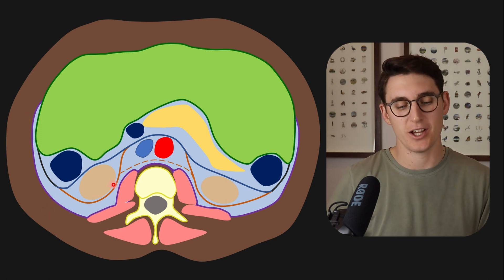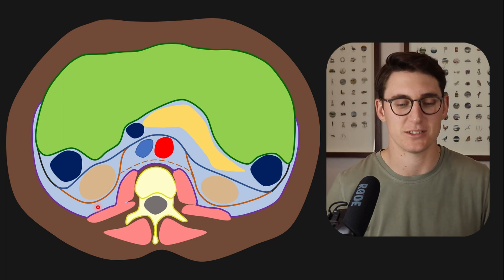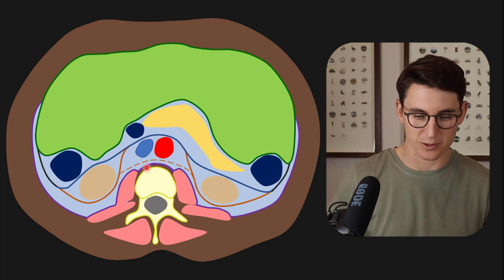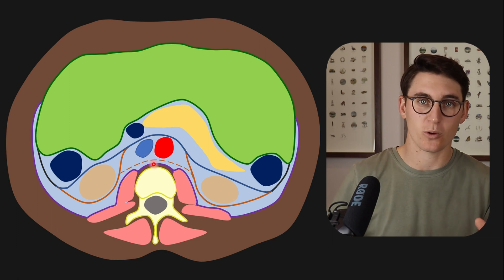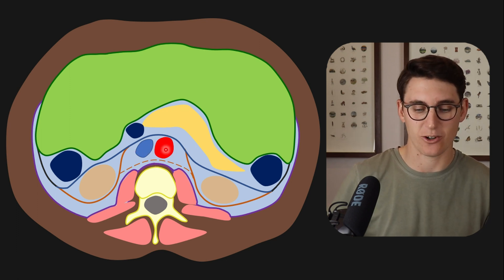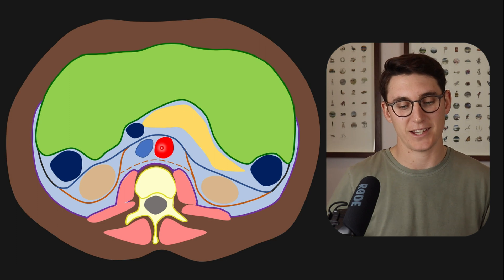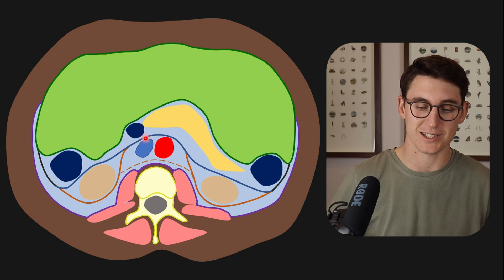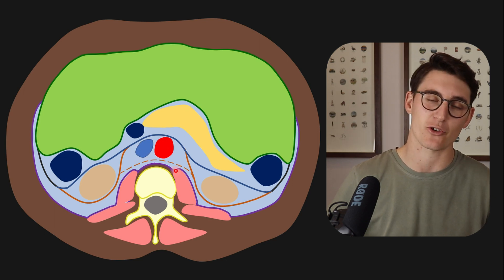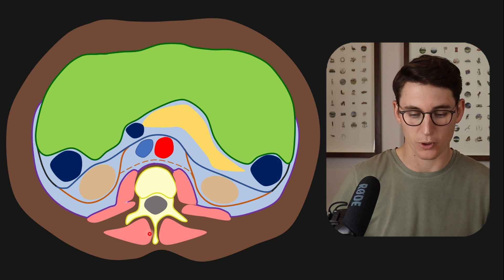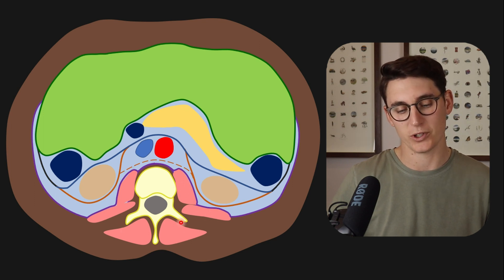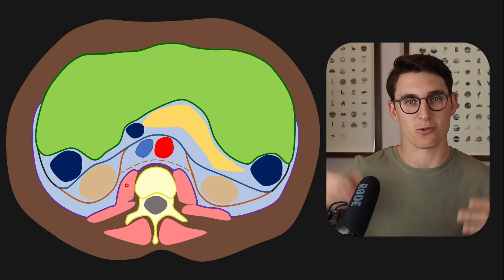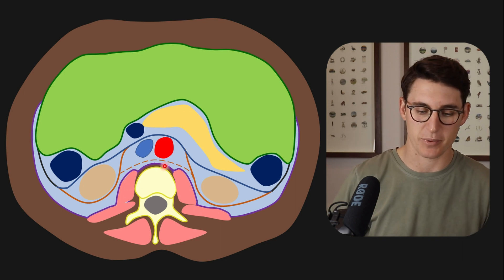So this is our posterior pararenal space — we've made our three spaces. Some people like to divide it slightly further and make a compartment that doesn't have defined fascial borders, which we call the compartment of the greater vessels, containing our aorta and inferior vena cava. That actually has communication with our posterior mediastinum. Some people also call the vertebral body along with our psoas and quadratus lumborum our posterior space, though technically that's not a retroperitoneal space — it's retro to the retroperitoneum, outside of the peritoneum.